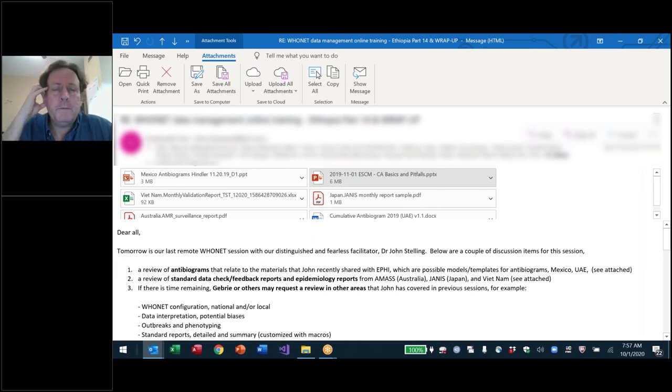So I would recommend for routine data surveillance, come up with a minimal set like age and gender, maybe date of birth, because it's realistic and it has epidemiological value, male versus female, young versus old. What are the pediatric pathogens? What are the elderly pathogens? If you want to go beyond that to the risk factors and all those things that I mentioned, that's valuable, but it's often not realistic to do this routinely forever in all of your hospitals.